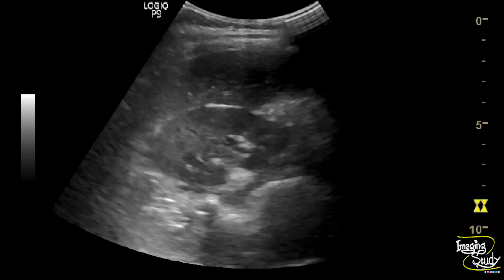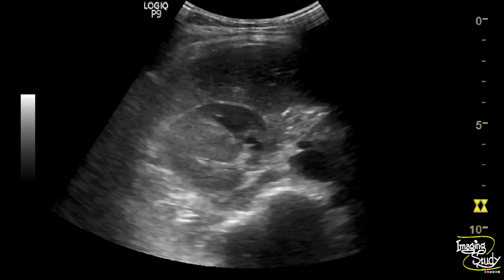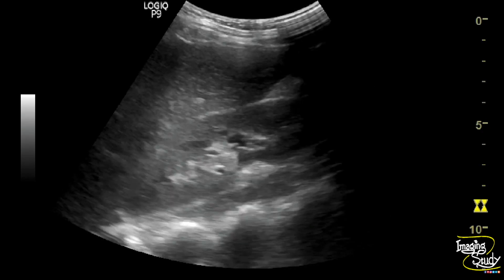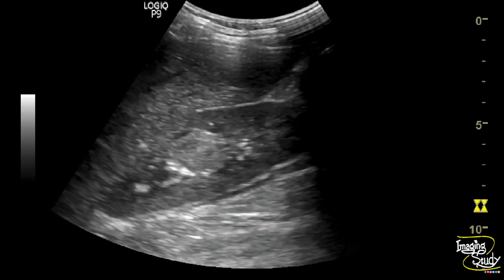So this heterogeneously hyperechogenic area indicates a case of focal pyelonephritis. Here you can see the magnified view of the longitudinal section of the right kidney, showing this heterogeneously hyperechoic area at the mid part of the renal parenchyma.